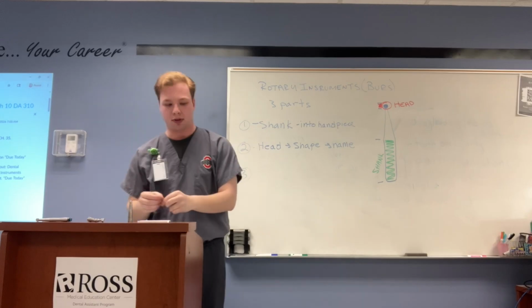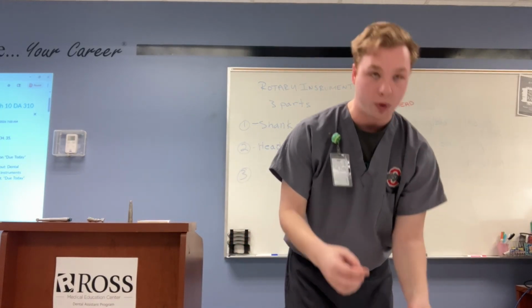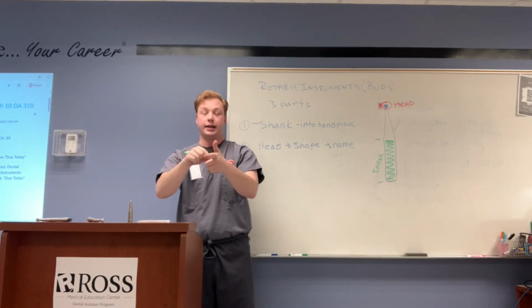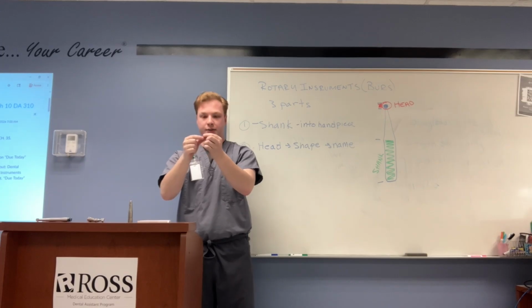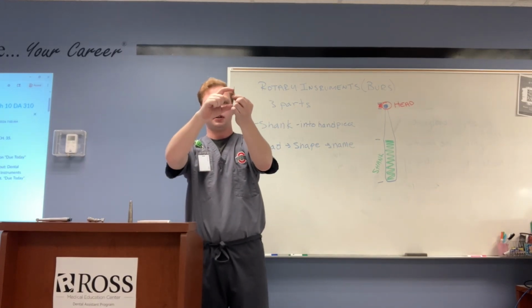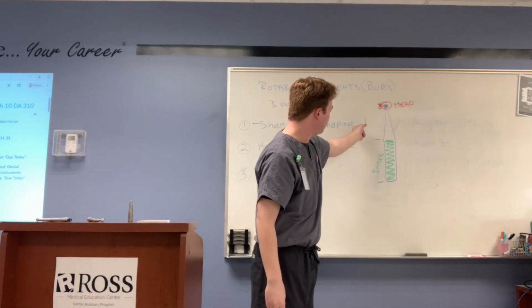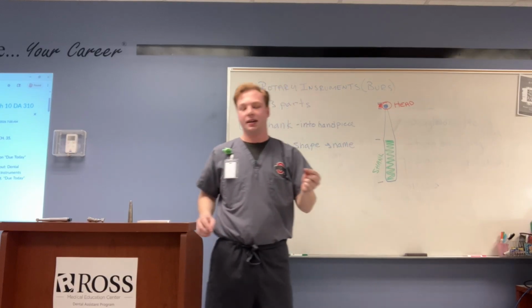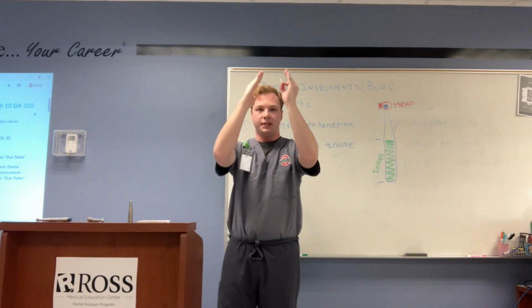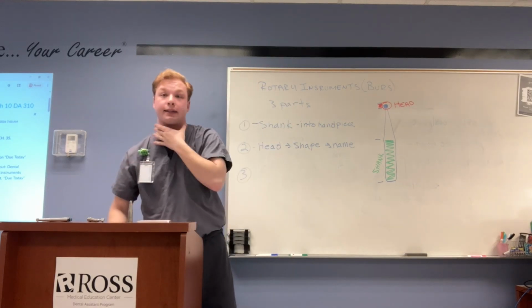But there's one other thing that you might see on a different type of bur. Whereas this looks like it goes straight from the shank to the head. And I know you guys can't see it, it's microscopic to you guys. But I hope you get the idea. But you notice the long shank and then the tip up here. I think I drew this one, sort of. But then where it deviates in to get to that really small ball at the end, that's the neck, right?